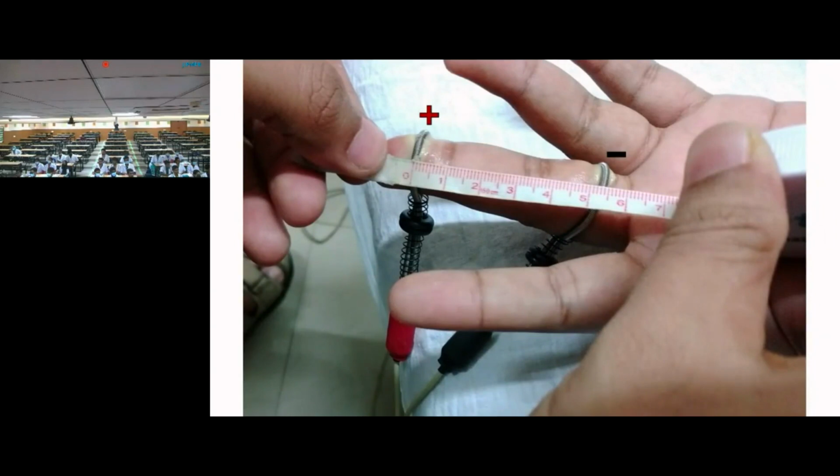So what you are going to do, you are going to place the active electrode, that is your recording electrode, in the proximal interphalangeal joint. And here you are going to place your reference electrode. The distance between the active electrode and your reference electrode is going to be 5 centimeter.